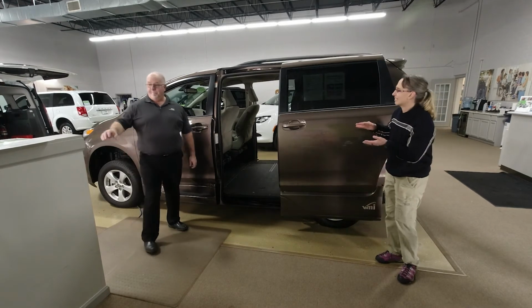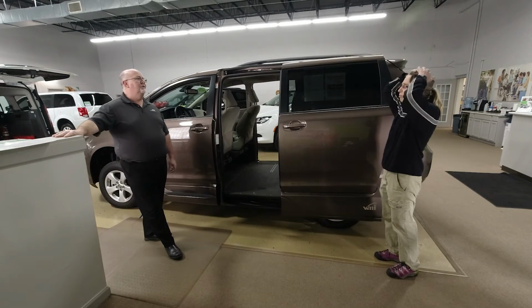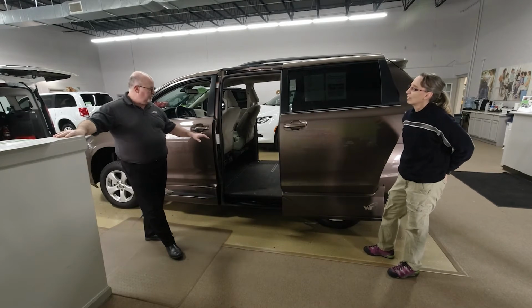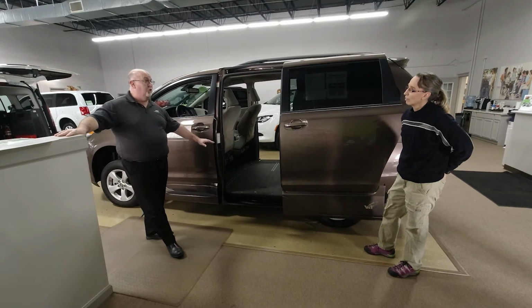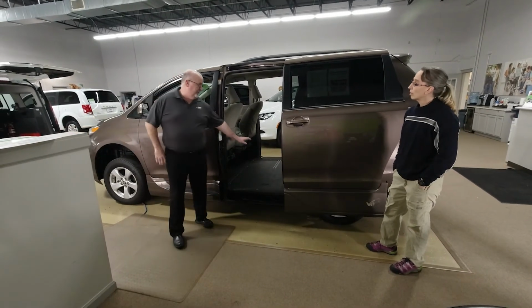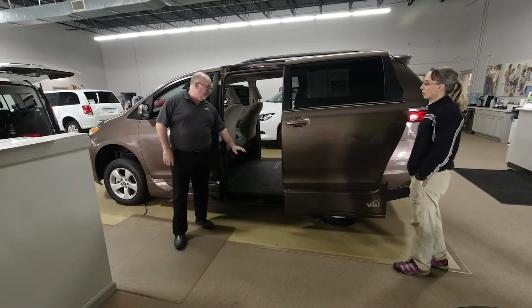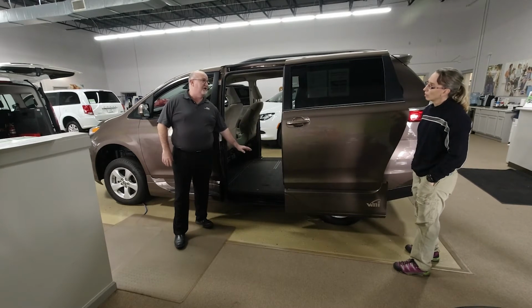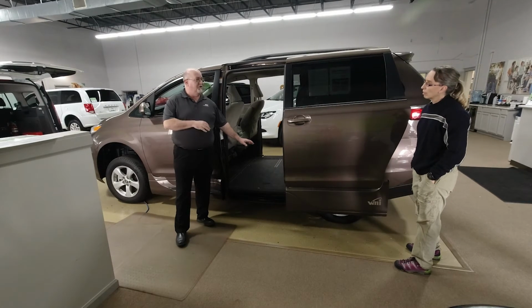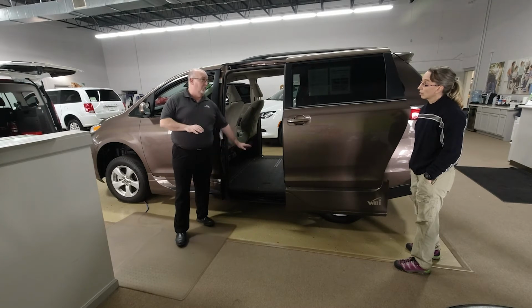Sometimes people have to get vans where the floor is lowered or the roof is raised. When do you have to do that? Pretty much all the conversions are done to the floor. To the regular floor of it? The regular floor. What ends up happening is it goes to Braun or VMI, and there's other companies out there, but they're the two big ones. They completely take the chassis off the bottom of the van, replace it with their floor, and depending on what the conversion is, it can lower anywhere from 8 to about 12 inches. They lower the floor of the van.